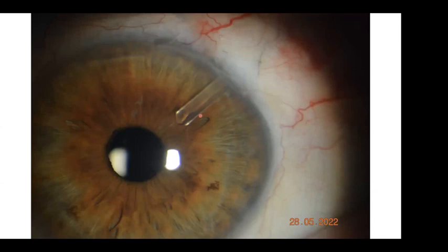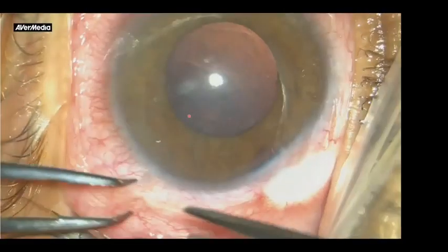And I like to measure the distance as half the distance from the limbus to the pupil. This one is slightly longer, but I'll be satisfied when it is half the distance on the surface of the iris. So again, this is the video.